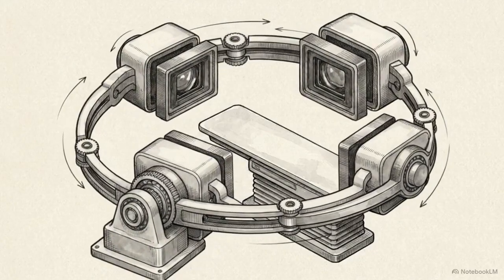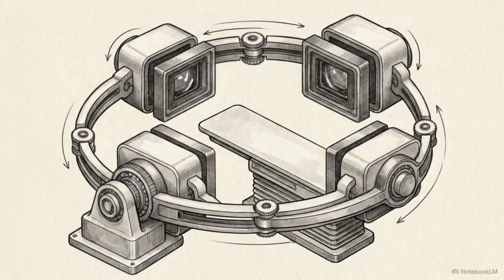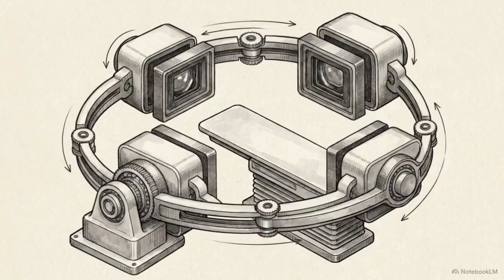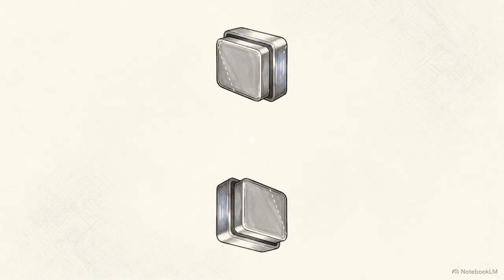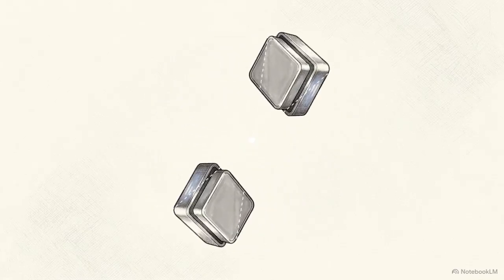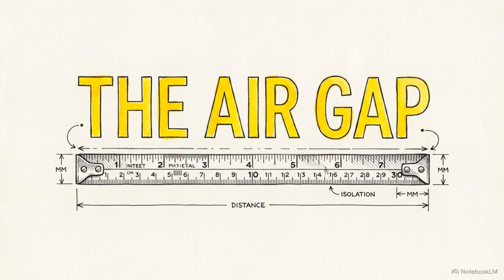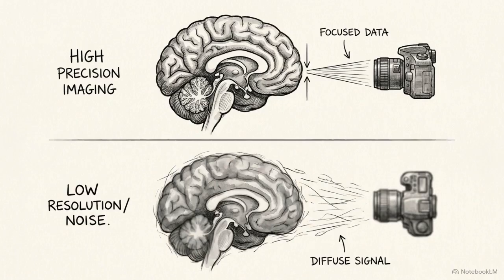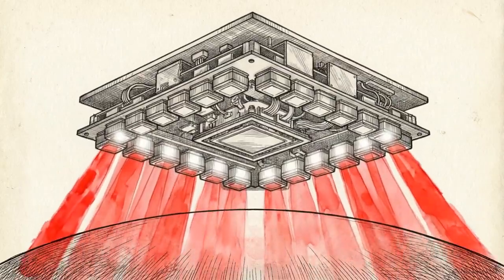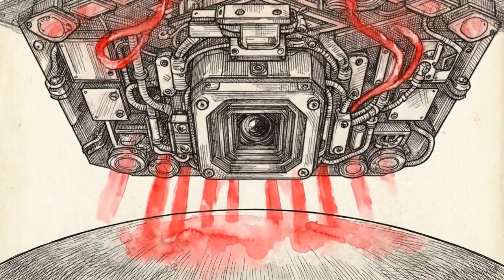Moving outward from the detector, these multi-head gamma cameras are mounted on a massive gantry, utilizing slip ring technology to rotate smoothly around the patient. Constructing a valid 3D image requires mechanical precision, a constant rotational speed, perfectly parallel detectors, and an accurately aligned center of rotation. Yet the most pressing mechanical variable is distance. As the gap between the patient and the camera increases, the spatial resolution degrades severely. To solve this, modern systems use infrared beams fitted to the collimator face to map the physical contour of the patient's body in real time.